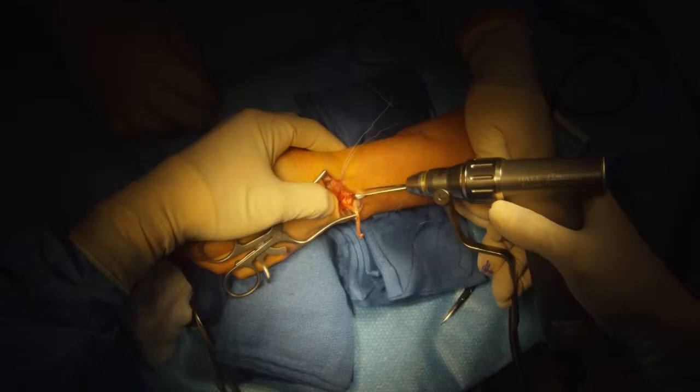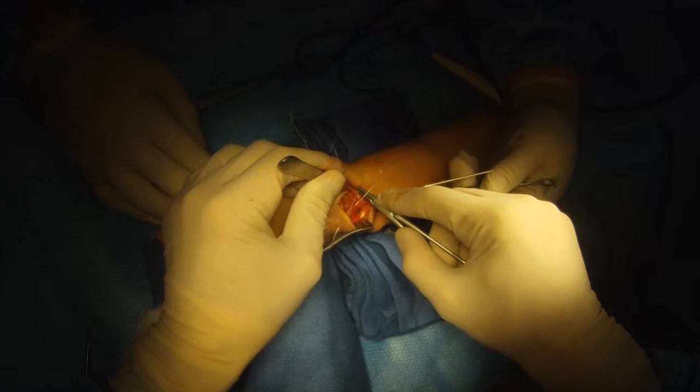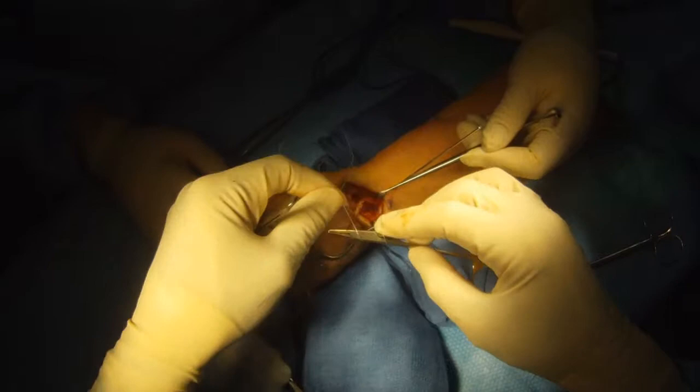Now I've reduced the wrist so I have the bones exactly how I want them, and I temporarily pin them in that position. Then we're going to tie down and tension the tendon graft in a firm manner to reconstruct the scapholunate ligament.